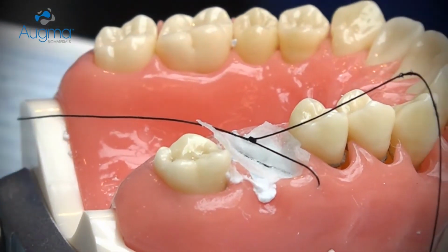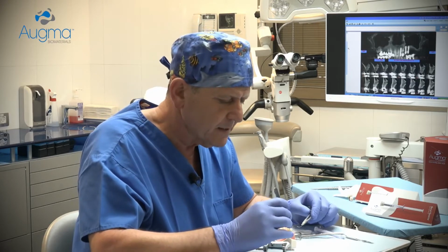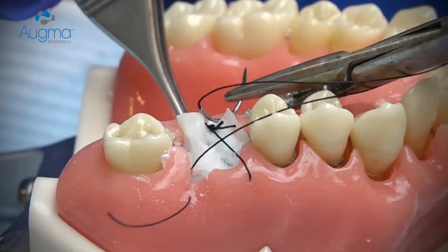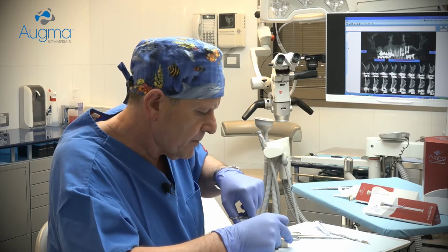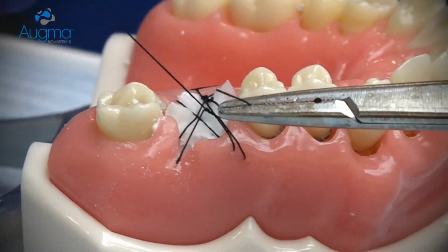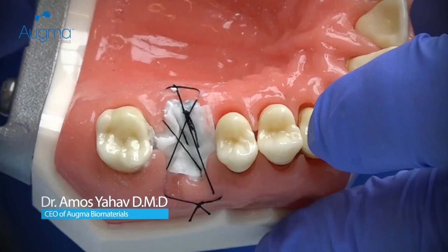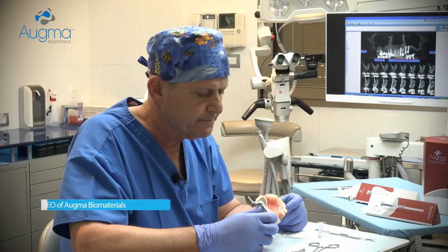After stabilizing the collagen sponge in place, or the membrane in place, you continue with a crisscross suturing in order to protect it in a better way. Now the graft is protected and you can leave it exposed in that way. Soft tissue will migrate above the graft and will close the area. That's all.